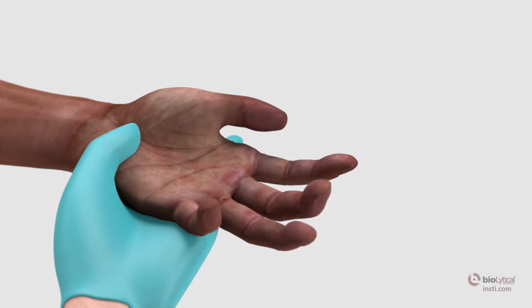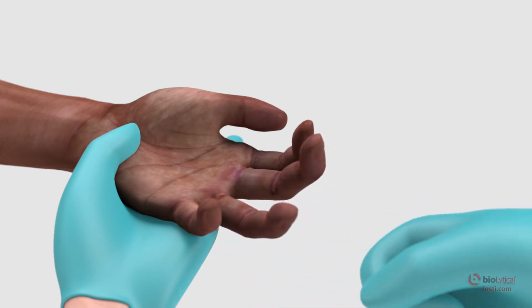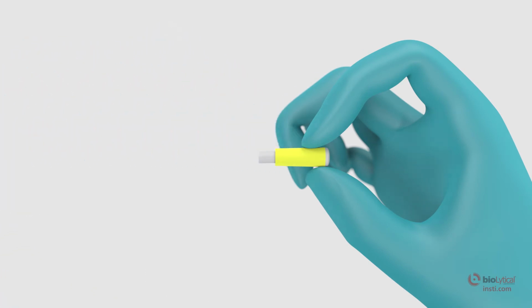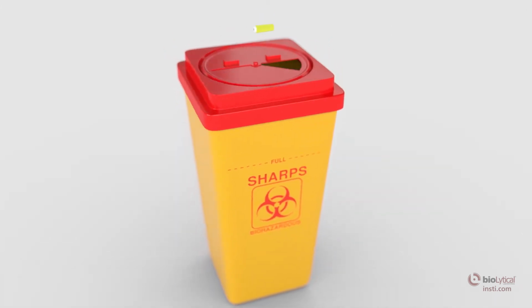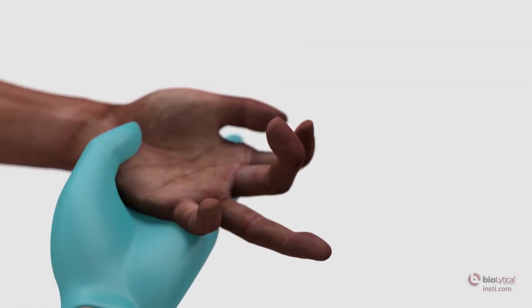Massage the patient's finger in one motion towards the tip to allow the blood to move to the surface. The fingertip will become slightly pink. As soon as the finger is dry, twist and remove the protective tab from the lancet. The appropriate areas to prick the fingers are indicated. Position the lancet just off the center of the finger pad. Holding the lancet by the body, press firmly to fire. Release the patient's finger and immediately dispose of the used lancet into a proper sharps container. Do not squeeze blood from the finger until you have the pipette ready in hand for collection.